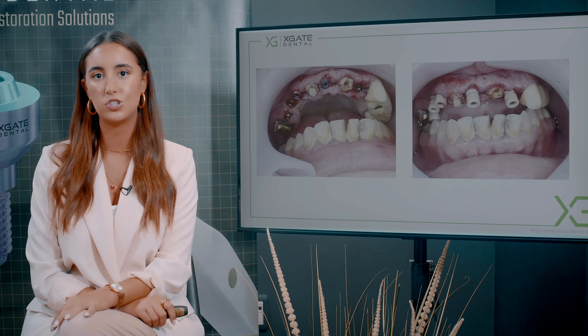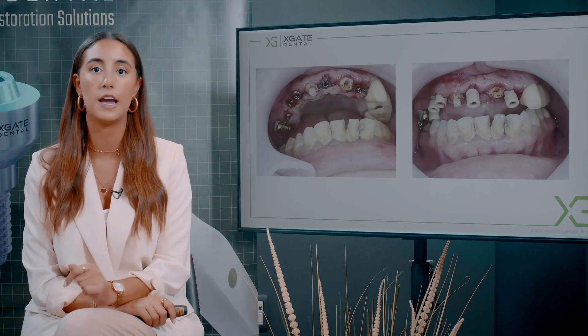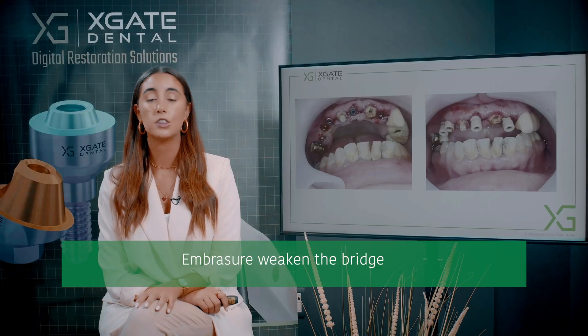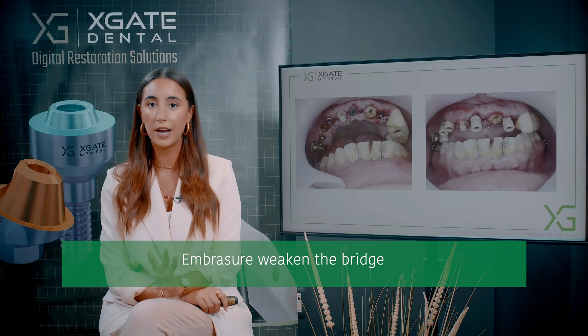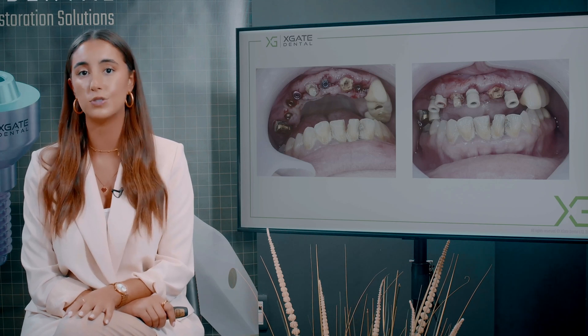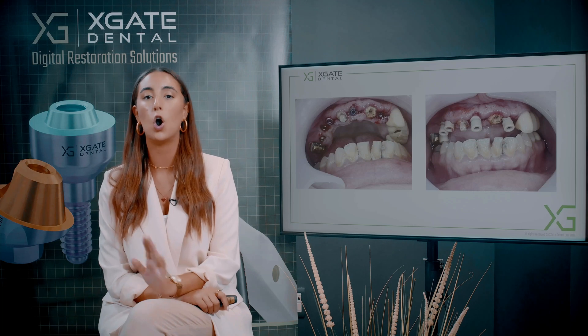Because it's a temporary bridge cemented on only three teeth, you need to have a massive temporary bridge. You can't have a temporary bridge where all the embrasures and the gingiva look ideal, because every embrasure you make weakens the bridge. When you weaken the bridge in this case there can be fractures and a lot of issues. You want this bridge to hold for at least three months until you can load those implants. There are many considerations when performing a temporary bridge — you need to think about all of this.